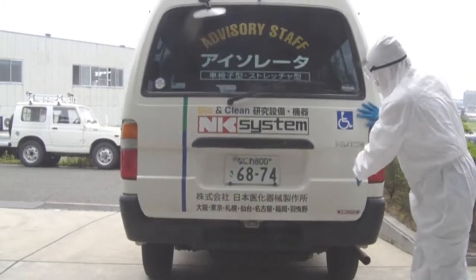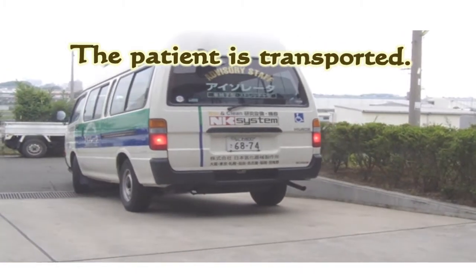The lock button is turned on. The patient is now ready to be transported.